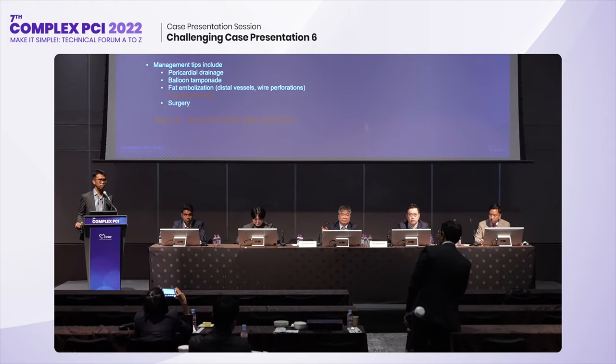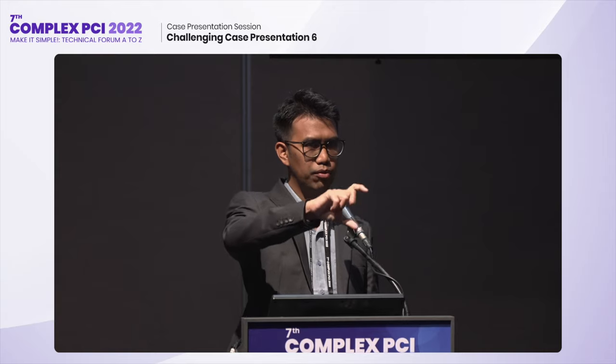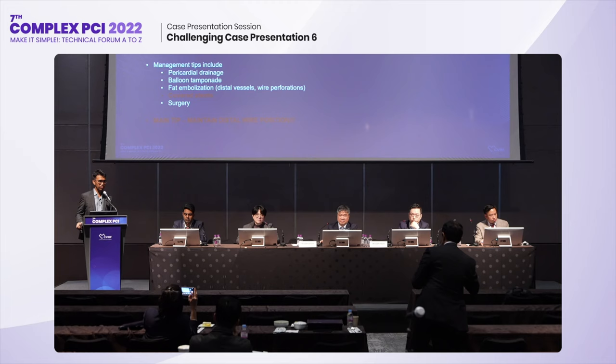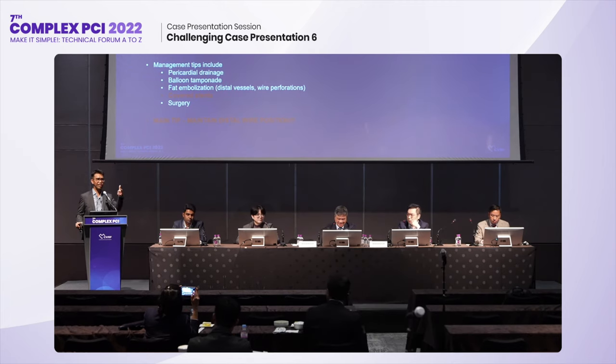I might be wrong in thinking; if I'm wrong, just correct me. Was your first covered stent too short and too big in size? If you take from normal to normal, that's not more than 2.5. So what I felt was that your first covered stent, being too big, could not close the perforation distally. Is it so? That's my thinking, might be wrong. It's difficult to say, because I thought initially the coverage was good, and actually the 2.5 I just put to nominal at the time. The first one was too big. Maybe that could have been the reason the perforation was persisting. It might be possible, because it looked like it had failed. The leak was distal, like an edge, going backwards.